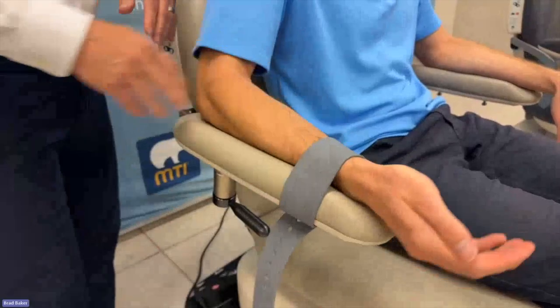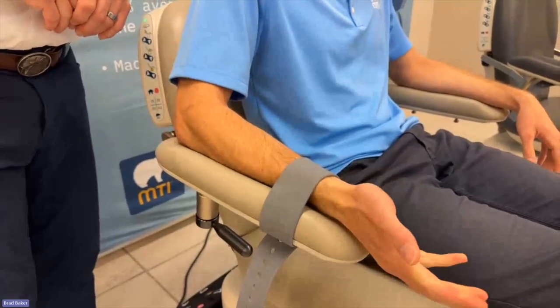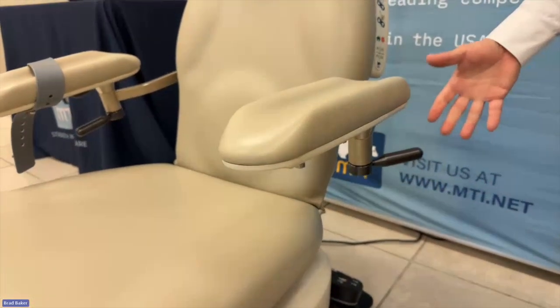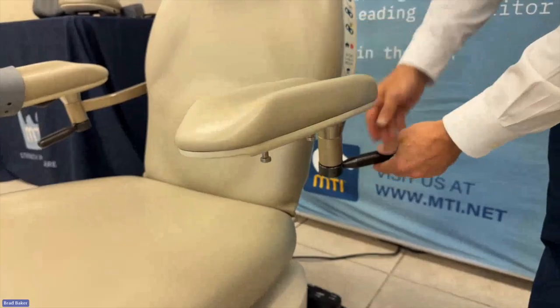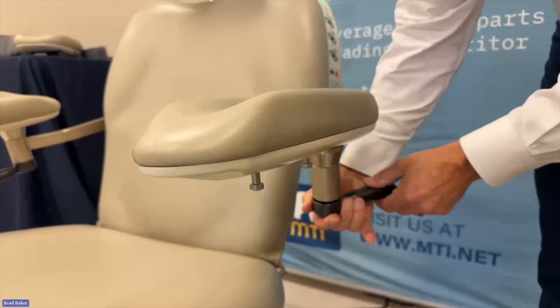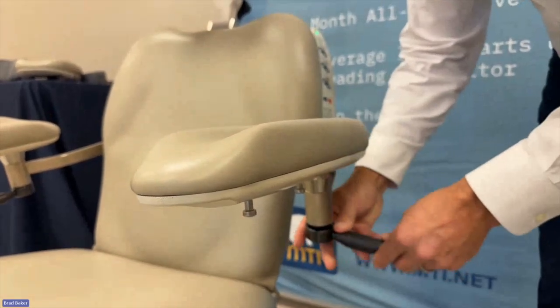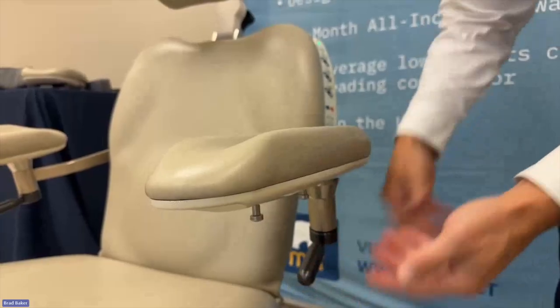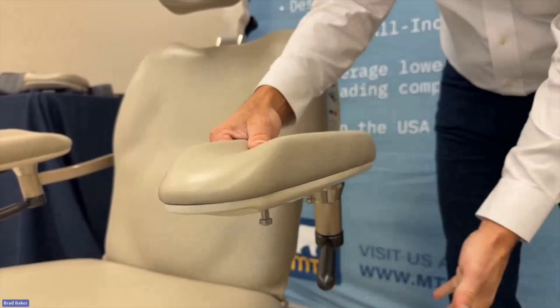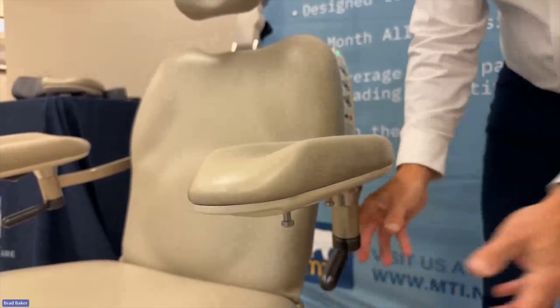And so now that patient's wrist, when you try to pull back on it, it won't allow that arm to slide backwards. So let's just say the arm lock ends up there and you don't want it there because you want to stand right there. Well, with our arm, it's locked, it's in the lock position. All you do is pull down on this handle right here and then rotate it wherever you want that to end up. And wherever you leave it is where it should always remain for the future times you lock and unlock the chair. If it ever gets out of the way, you just pull down, rotate it where you want it to go, and release it.